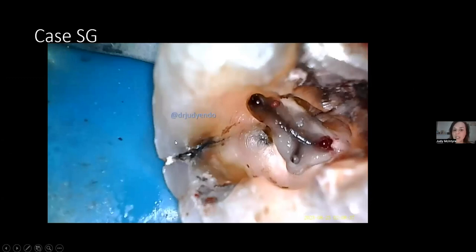So clinically, this was her tooth. You can see the crack, and faintly, it even goes faintly across the entire pulpal floor. Let me do that again. So big, big, big. My explorer catches here. My explorer catches a little bit here. My explorer does not catch, and I'm in the pulp now. I'm in the chamber here. Mesiobuccal, distobuccal, palatal canals, right? Faint crease line, faint crease line, faint crease line, and then I'm catching again with my explorer.